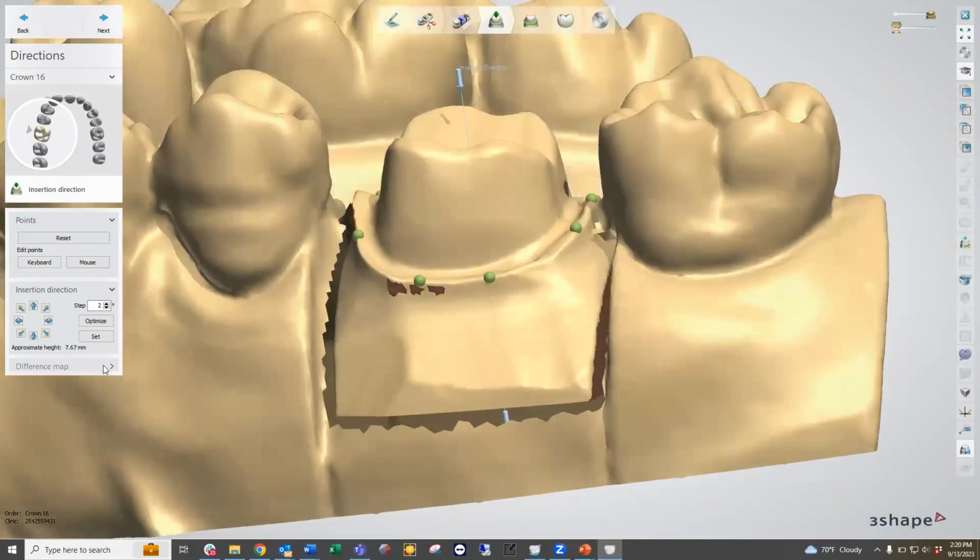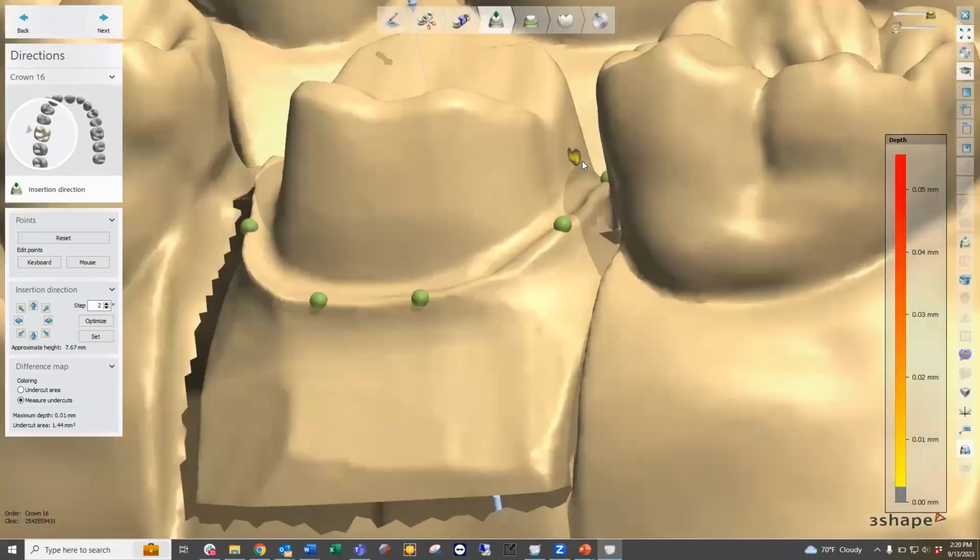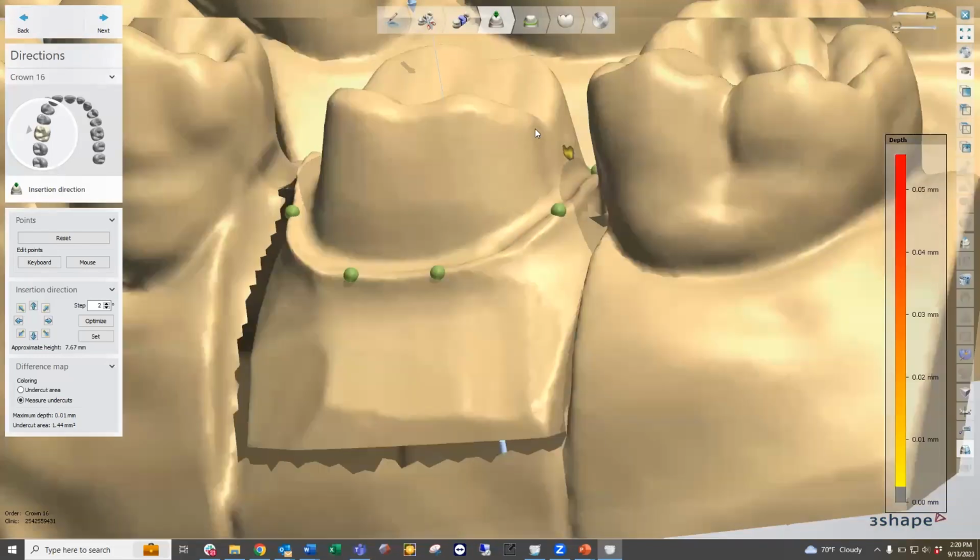Okay, next we can go ahead and take a look at the undercuts, and you can measure the undercuts if you would like, which allows us to see the depth of the undercuts. And we can see anything in yellow is going to be less than 10 microns, so we're okay with that.